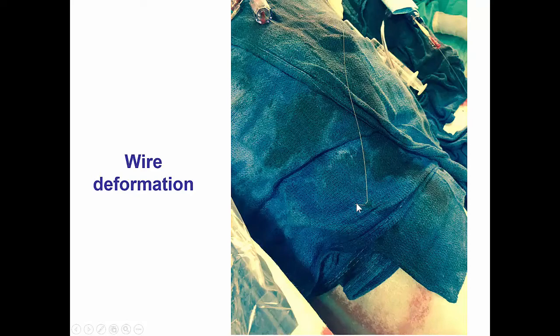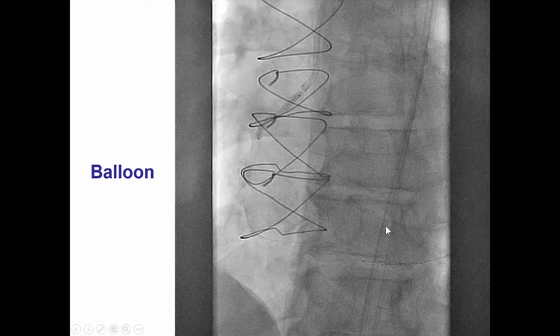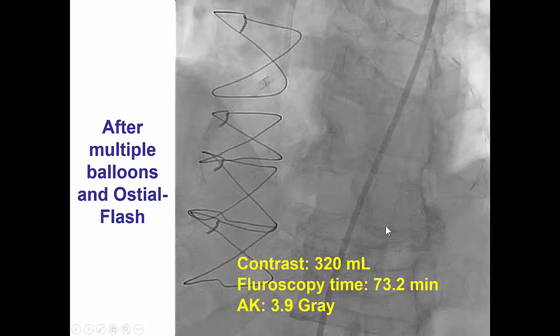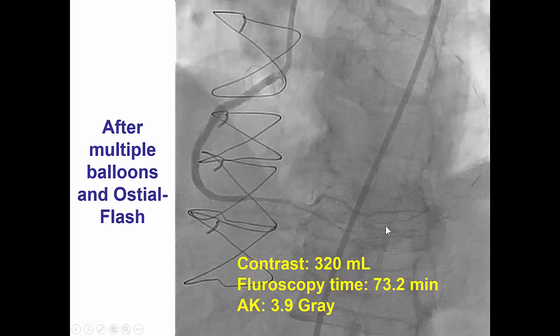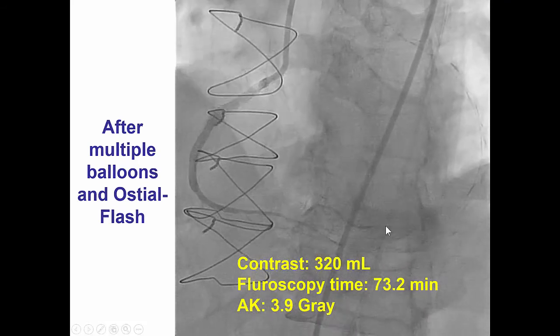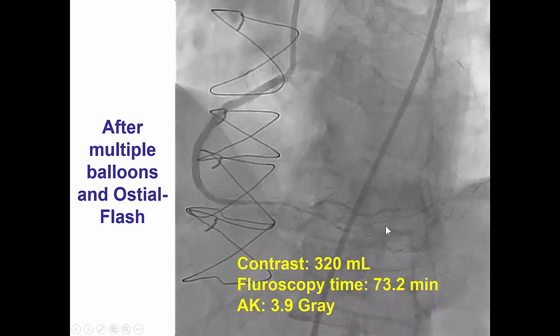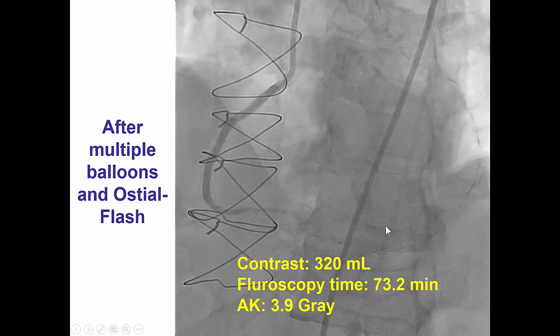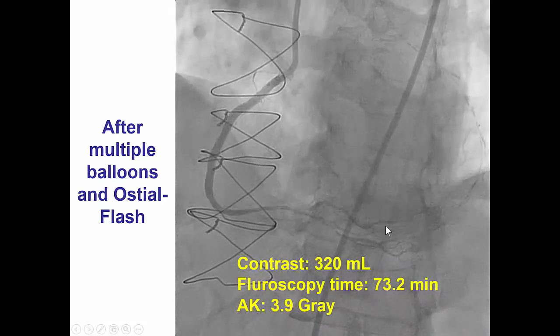This illustrates how challenging it was advancing the guidewires through the LIMA — there is significant tortuosity and deformation of the wires that have to navigate through all this tortuosity. The lesion was subsequently ballooned with high-pressure balloon inflations, and then after multiple balloons and use of an Ostial Flash catheter, we were able to recanalize the lesion and obtain an excellent result.